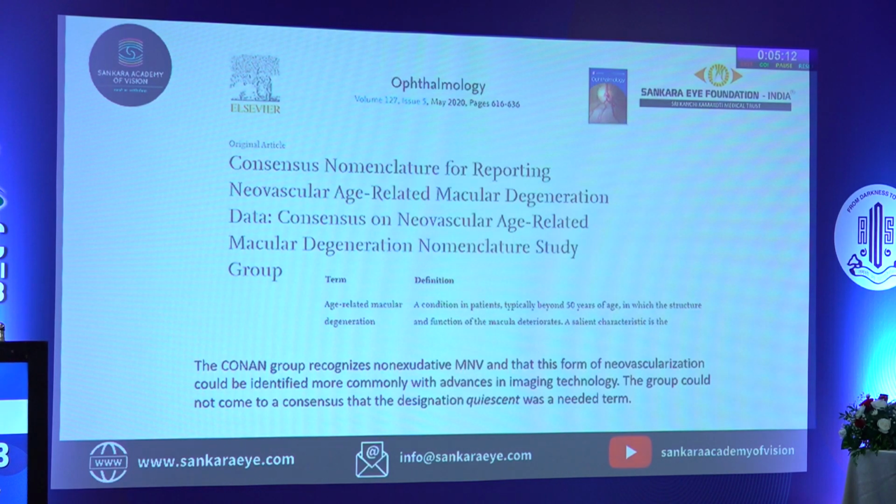So all those cases of sub-RPE neovascularization without signs of clinical activity, like exudation, that is fluid, either retinal or subretinal, and subretinal hyperreflective material or hemorrhage, if any of these are not there, then it is called subclinical neovascular AMD.